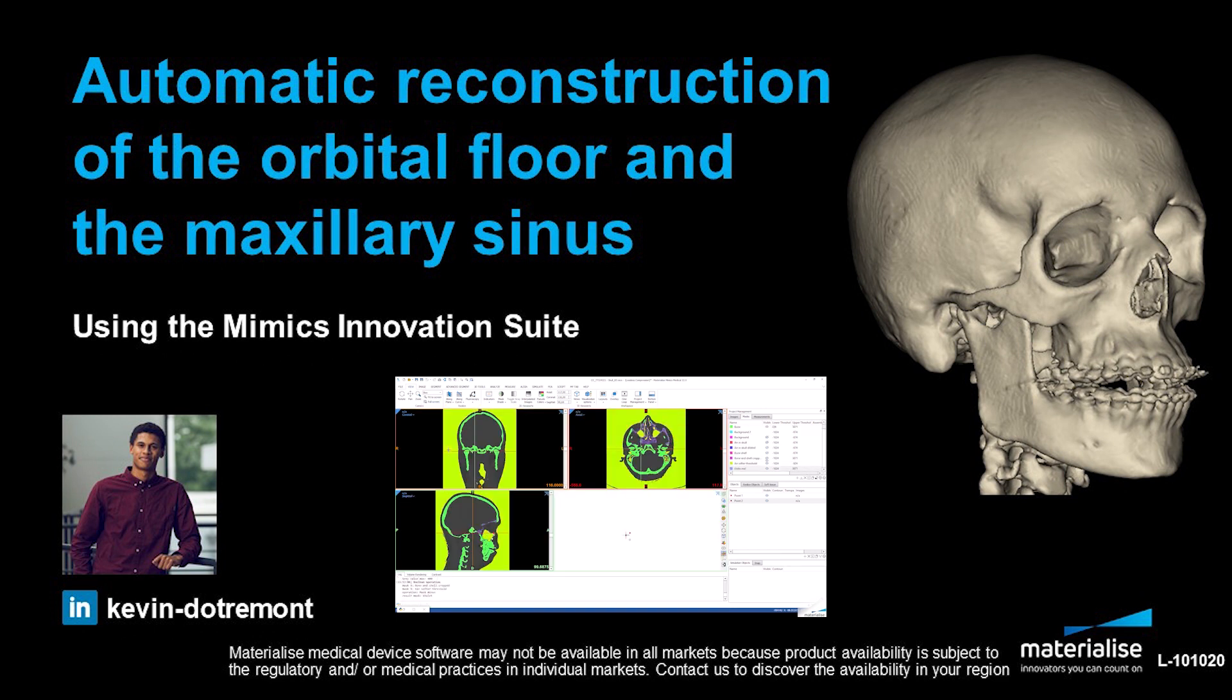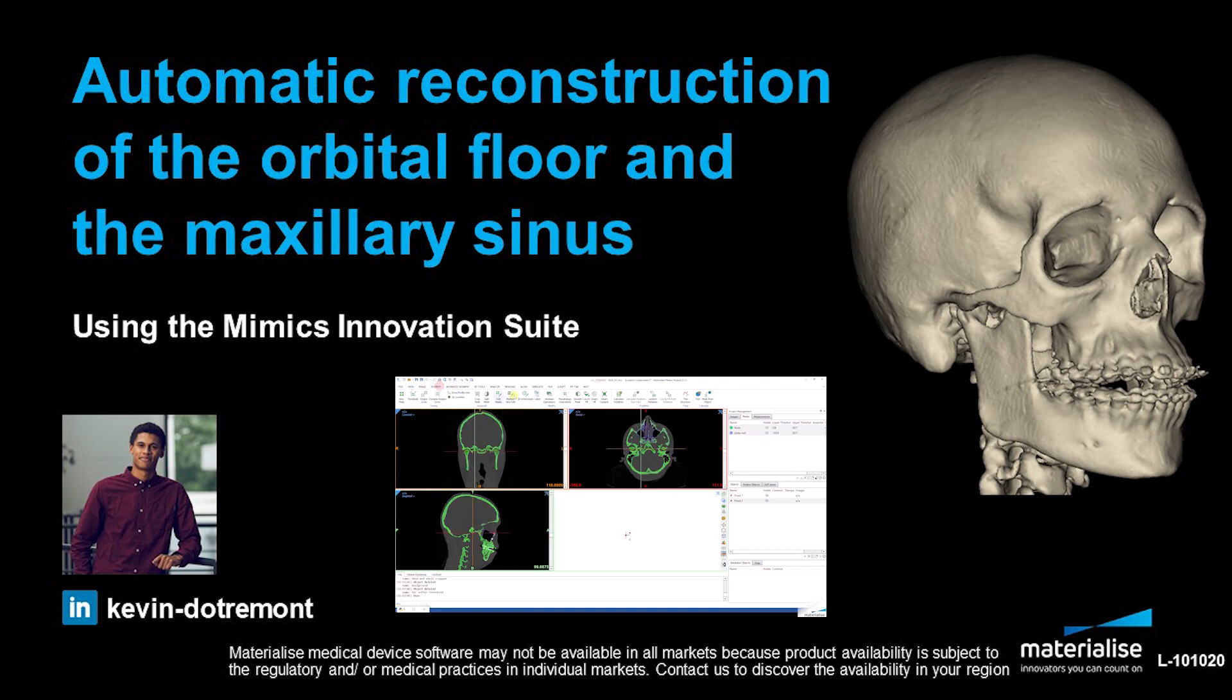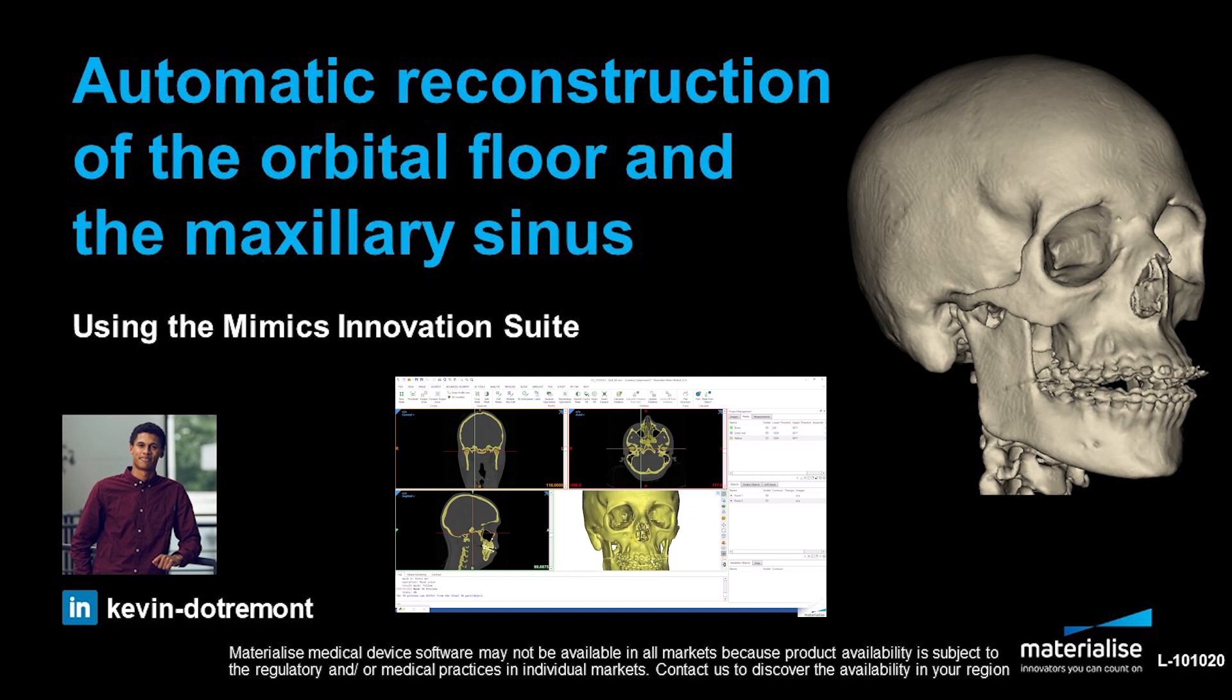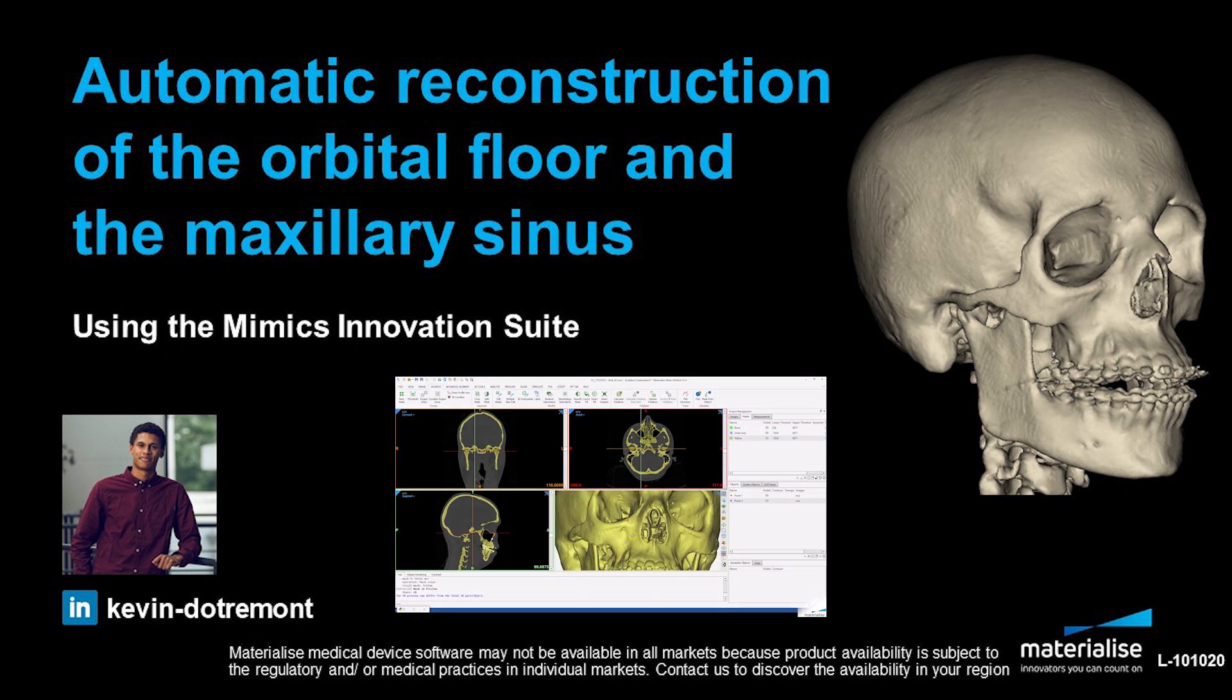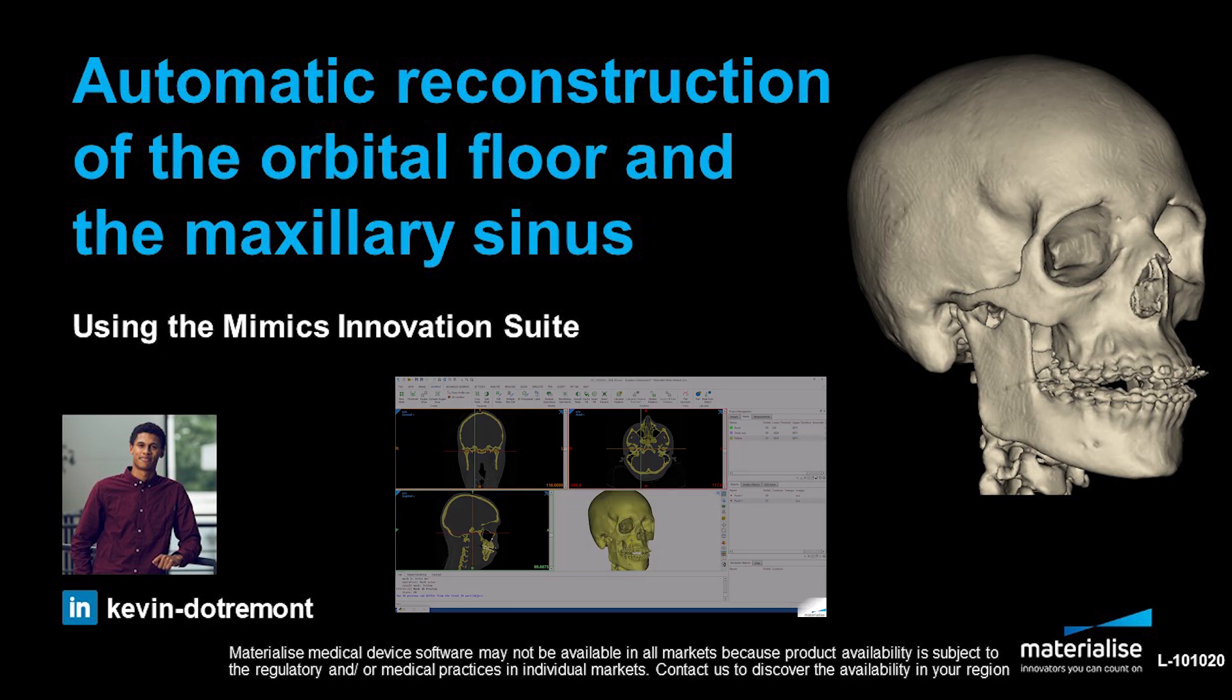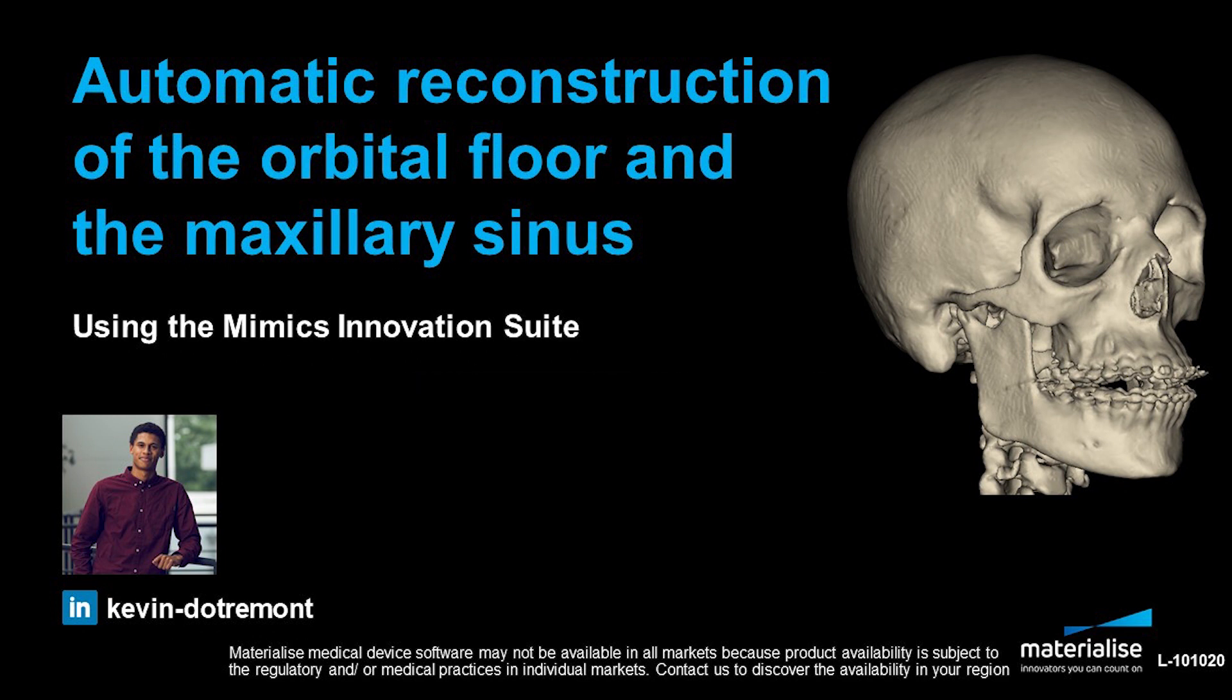In this case, we will use a script that segments the orbital floor and the maxillary sinus automatically. This will save you time and doesn't require manual work to obtain these very thin bone structures.